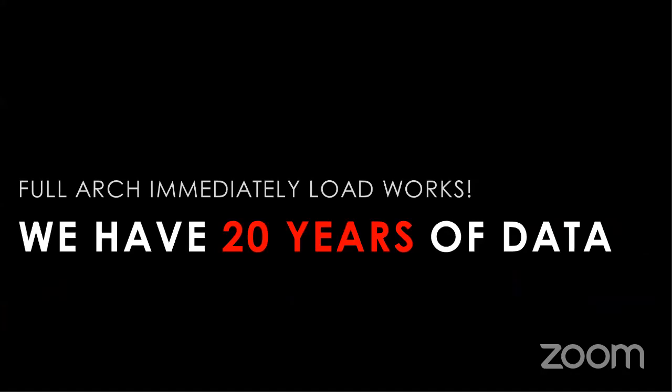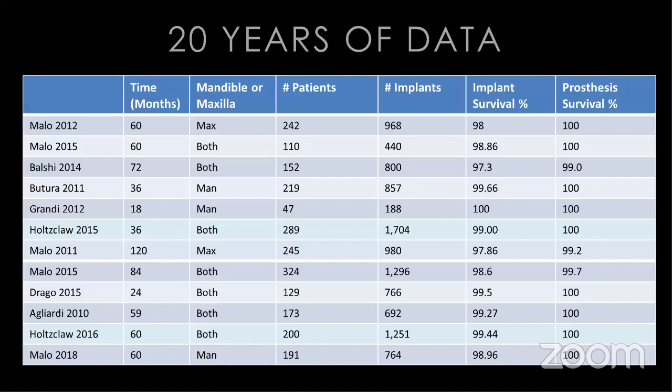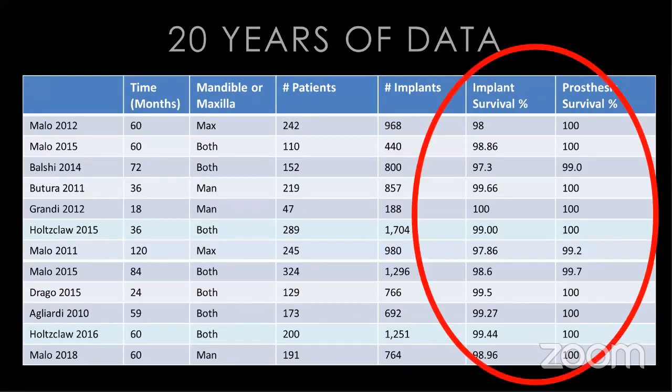We know that it works. Dr. Malo introduced this concept to us and did his first cases in the 90s. The first publication was in 2003. At this point in time, we have 20 years of data plus on this. We know that the implant survival rate is very, very high, much higher than individually placed implants, 98 plus percent. The prosthetic survival rate is very, very high, close to 100%.